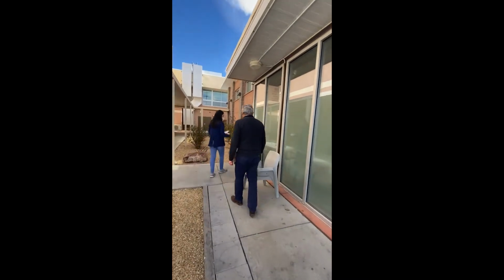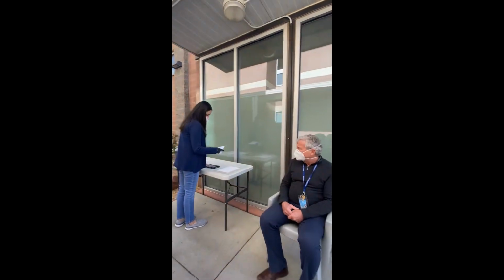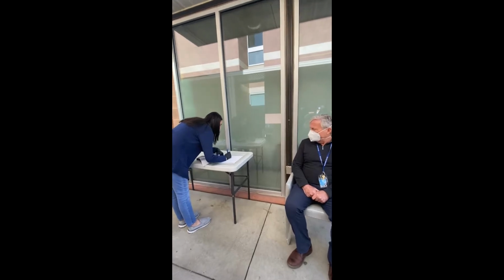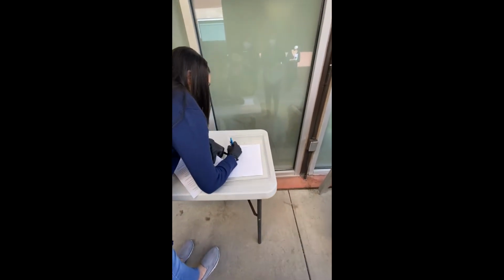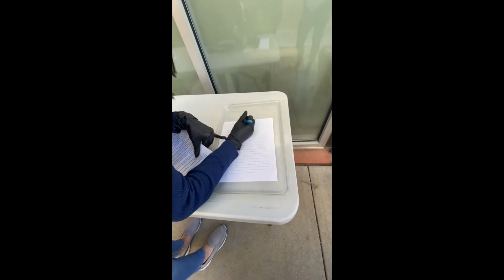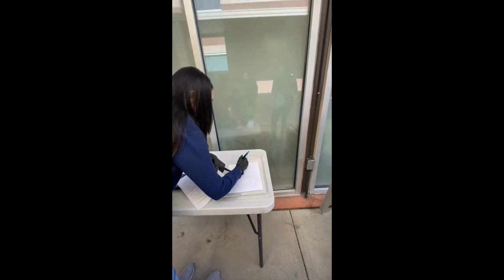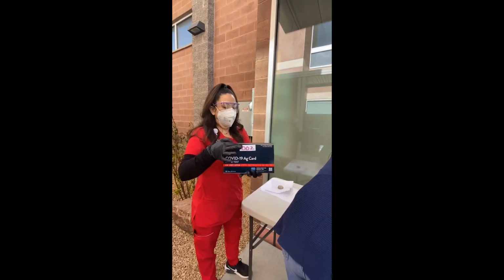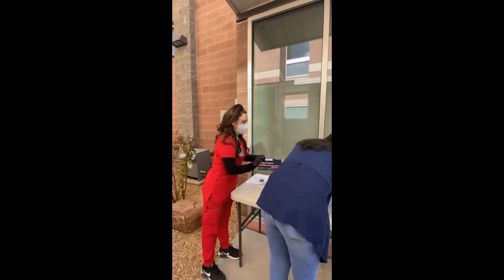Alright, Mike, have a seat. At this time, I will be completing the screening form. Jessica will complete the screening form, which will have the client's name, date of birth, and a location to list the test number. The test number is listed on the front of the test box. So the test number also needs to be listed on that form.